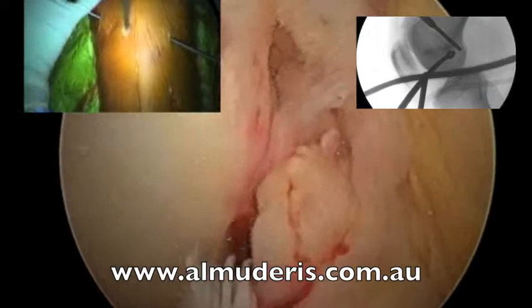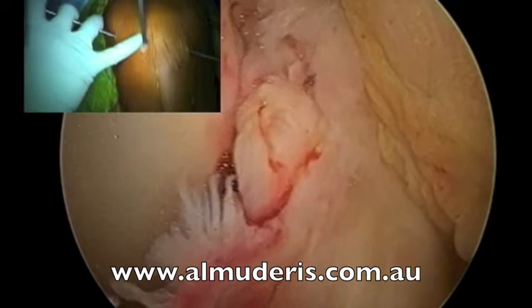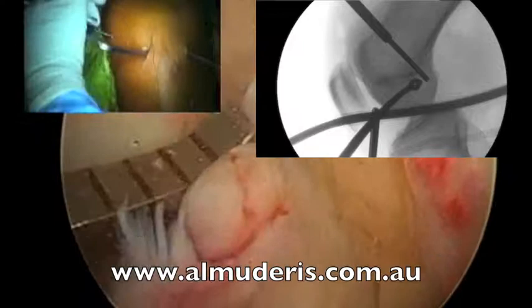Pull the trocar and take the guide off temporarily, then put the trocar in again. I make sure that the flip cutter is flipped. X-ray — it is flipped. Then I do a full circle with my hand and mark the area where the flip cutter sits on the femur. Then I go back. By 2 cm — that is exactly where we want it to end. As you can see, the tunnel is not very long; that is to preserve as much bone structure as possible.